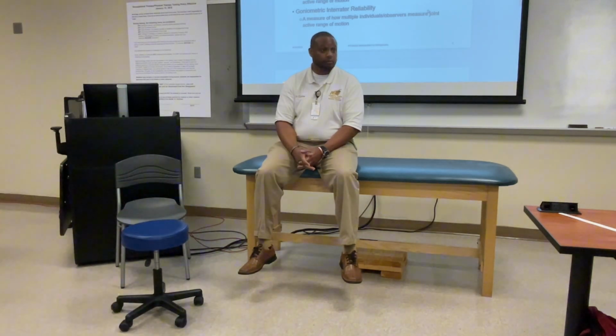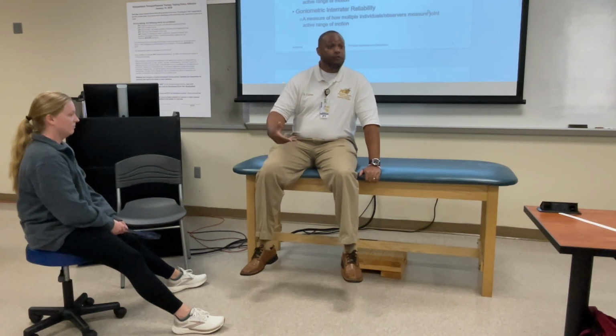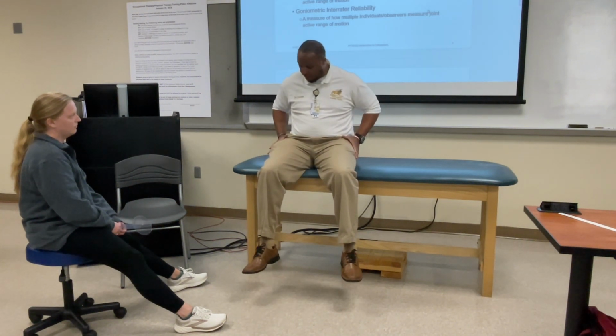Dr. Water? Yes. So I don't know, do you only have a towel? Or no? Okay, so that's a good question. Repeat your question again. Do you have to have a towel? Yeah. All right. Now she said, do I have to have a towel under my hip? Yes. According to Norkin and White, if the hip is less than like 60 degrees, then you want to put a towel to increase the range of motion of the hip. So right now, my hip is probably in an adequate position to do it without a towel.